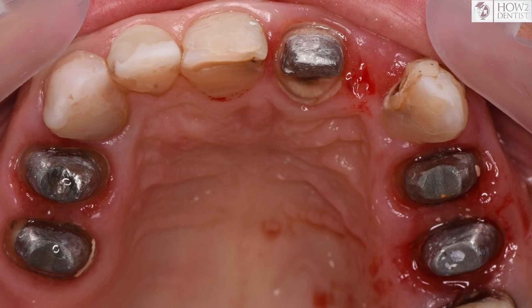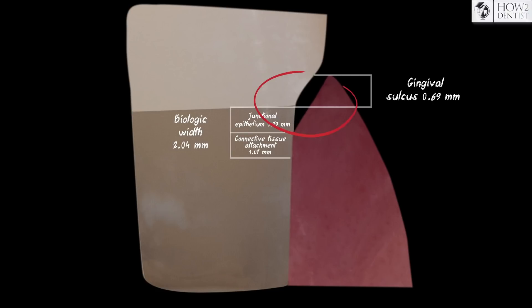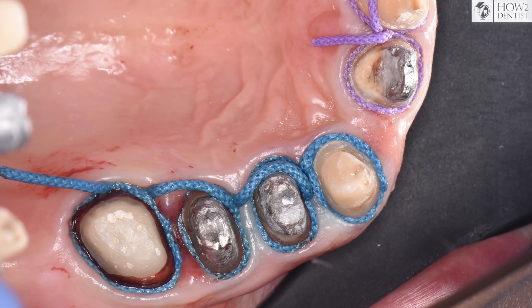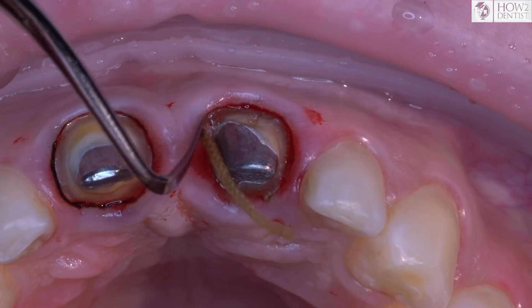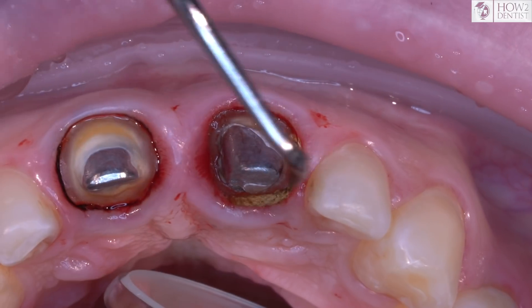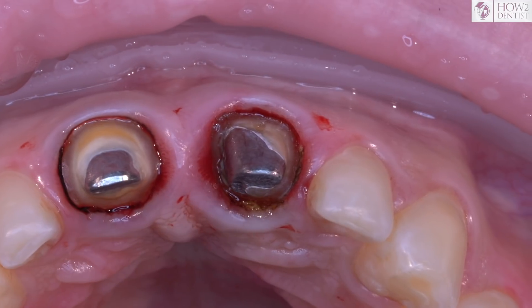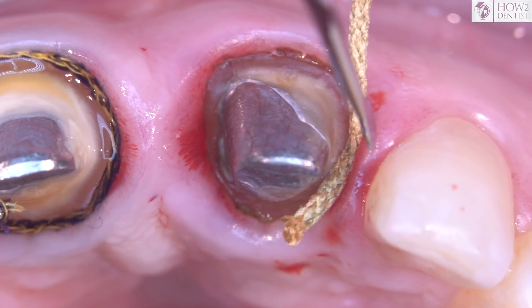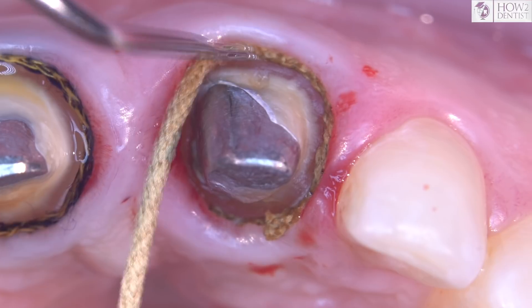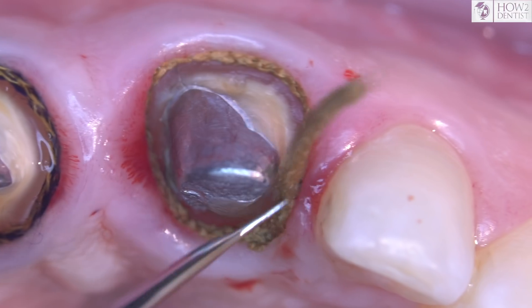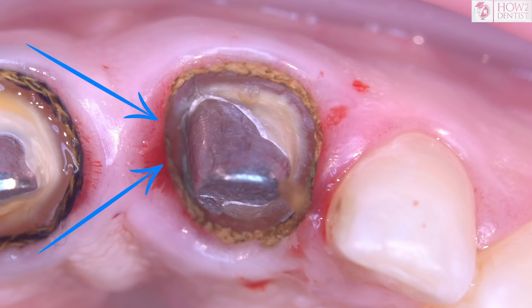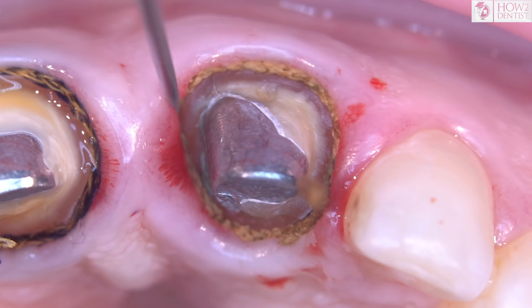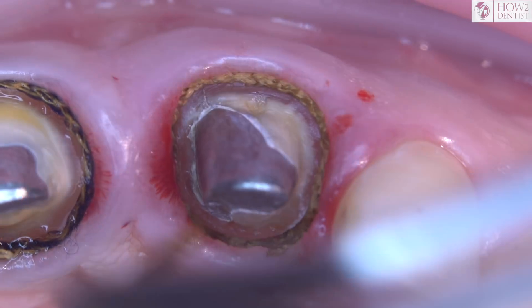In cases where subgingival preparation has already violated the epithelial attachment, it is often necessary to perform retraction with two cords. First, we set the first cord — often with impregnation and the smallest diameter sufficient for holding — and in this case the thread can be completely impressed into the sulcus. Then the second cord is set. The second cord provides horizontal retraction and for this it should be visible on the entire perimeter. If the size is not selected correctly, or the cord is packed too tightly and deep, the gum will collapse above the cord and will not provide proper horizontal retraction. In this case it can be pulled back a little or a larger cord diameter can be selected.